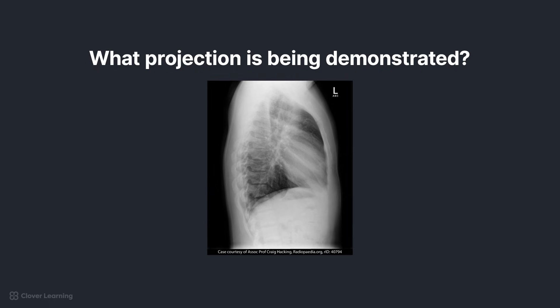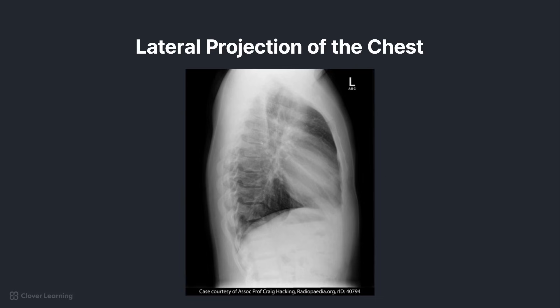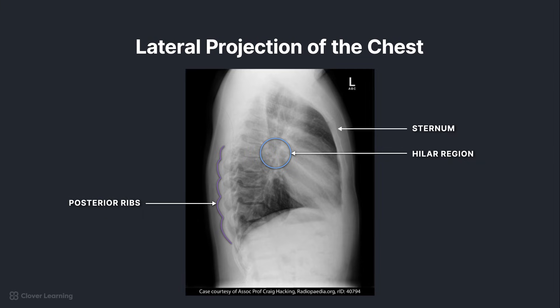What projection of the chest is being shown in this radiograph? If you said lateral, you're correct. This is the only other projection in the series, but how would you know it was lateral just by looking? Well, the evaluation criteria tells us that a true lateral is evidenced by the hila visible in the approximate center of the radiograph, superimposition of the ribs posterior to the vertebral column, the sternum demonstrated in profile, and the trachea visible in the midline.